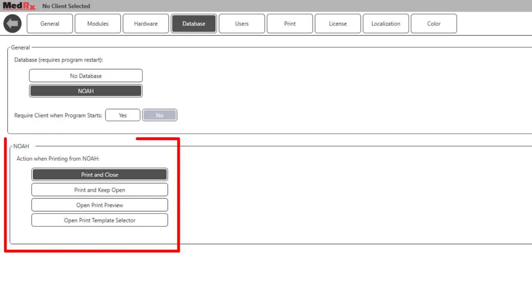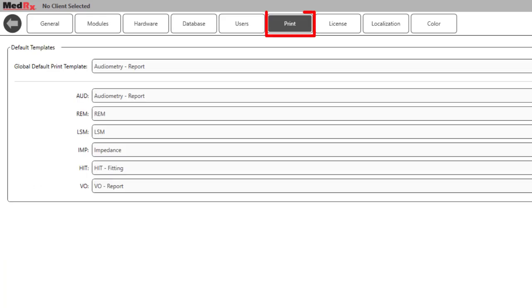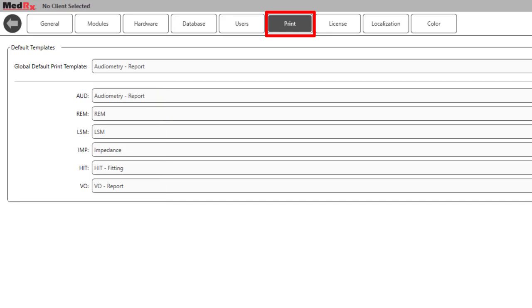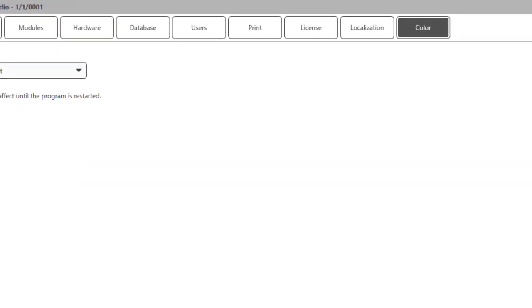The NOAA option determines what will occur when printing a report from NOAA. The Print tab allows users to assign default print templates by module and a default Studio Global template. The templates assigned will print when the Direct Print button is selected.